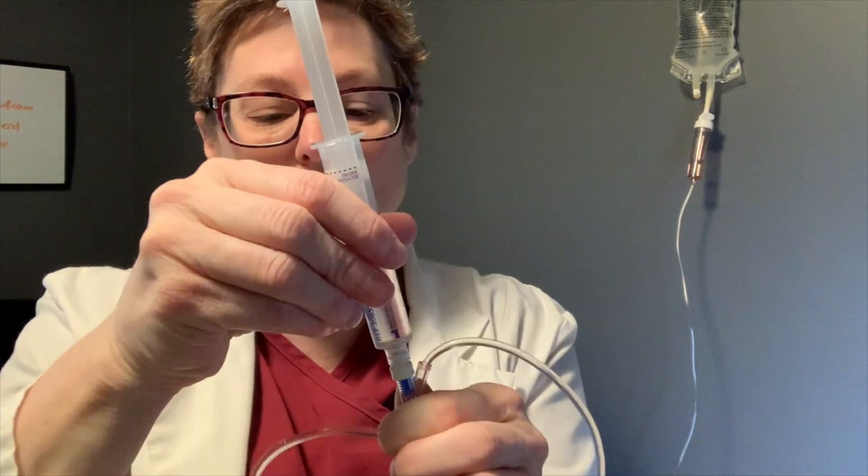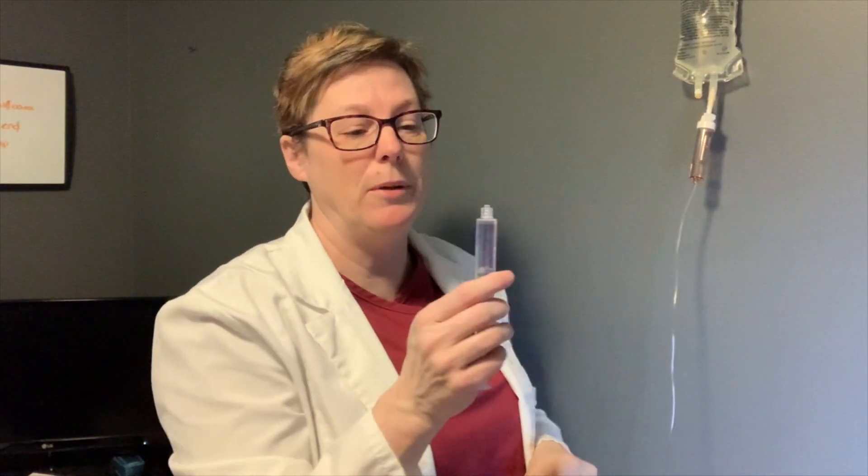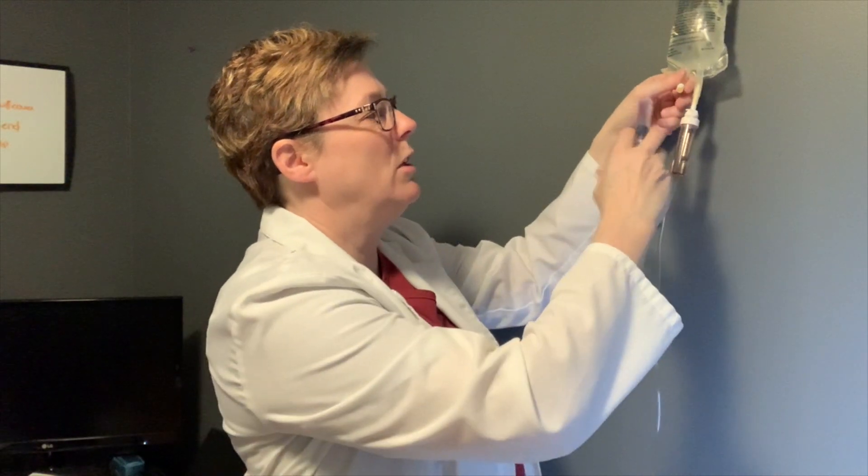Here's a question: what if this is medication? We definitely want to make sure the patient gets that medication. Detach here so the fluid can continue going to the patient. You could then reinsert the medication — clean the port, attach your blunt-end needle, clean the port, and infuse the medication back into the bag so the patient receives all of it.